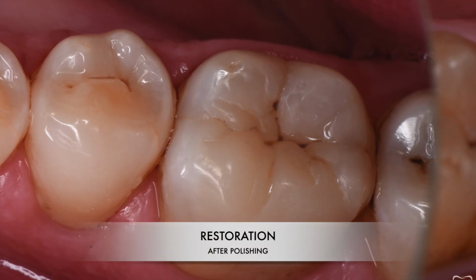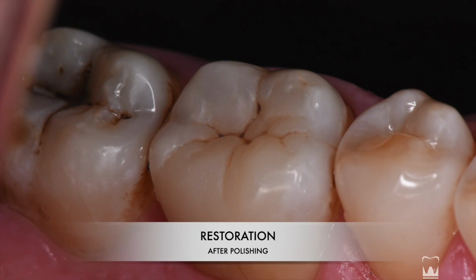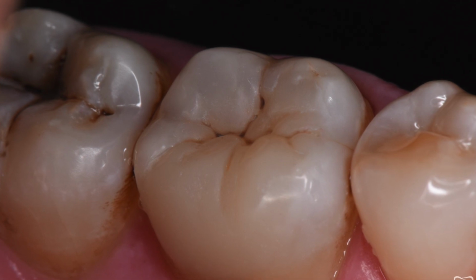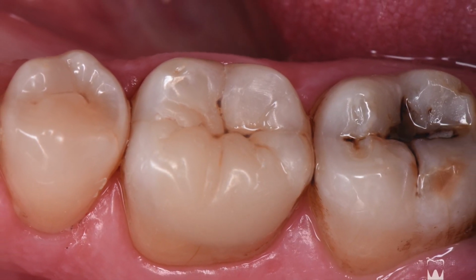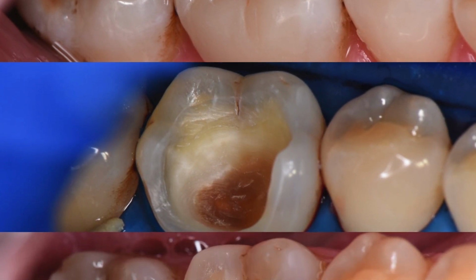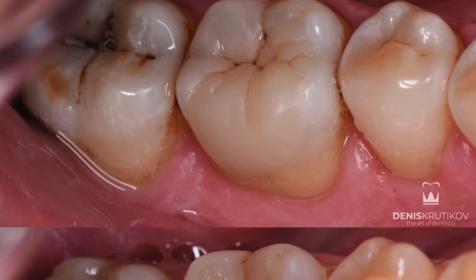And in conclusion, two points. First, many dentists consider this technique complicated and long, but in fact it is very simple. The most important thing is that the restoration is almost 100% accurate in occlusion. And second, before you start working with patients, practice manual skills on plastic or plaster models.